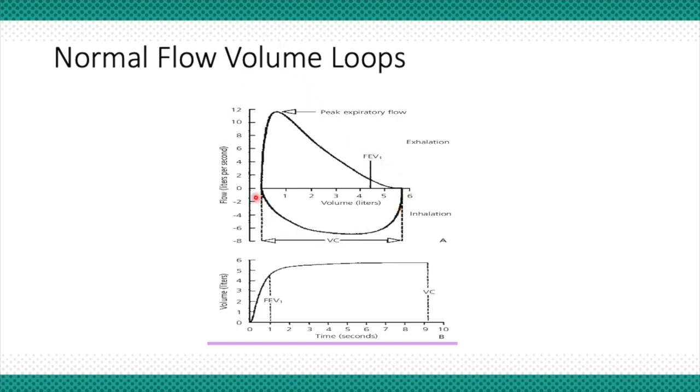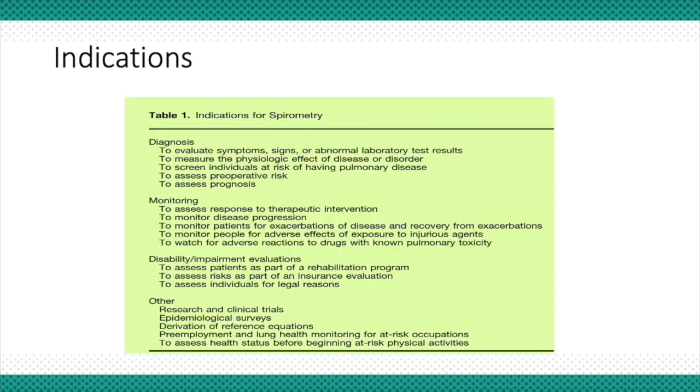This is a part of the change where spirometers have to meet certain standardizations. When we do that, we assess the flow versus volume or the volume versus time, and the peak expiratory flow, further with the flow in the first 25%, the 25 to 75%, and 75% of our expiration, for the patient to reach the vital capacity or forced vital capacity, and then he inhales back again.